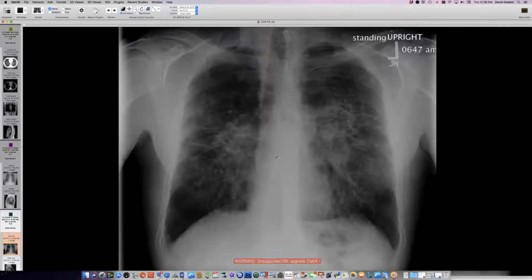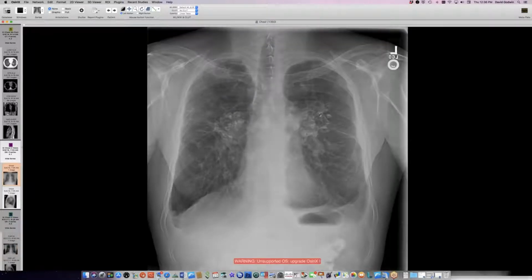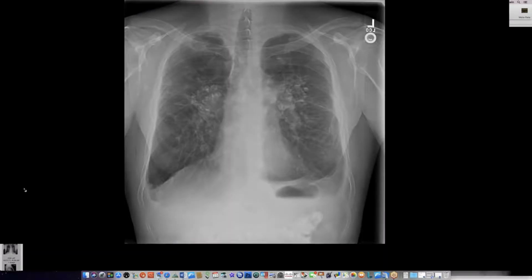This is outside radiographs on this person from 2011 with lots of bulky stuff here, mid-lungs again, and around the hila, maybe some pleural effusion or thickening, unusual in sarcoid. And then here is more current imaging now on this person. And there's been a lot of scarring. And now we have this central scarring pattern with a very nice, probably PMF pattern here. I'll show you CT in a minute.